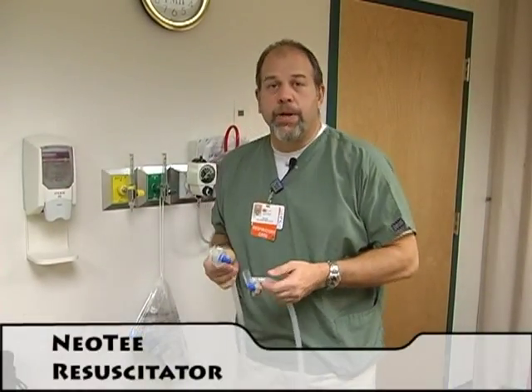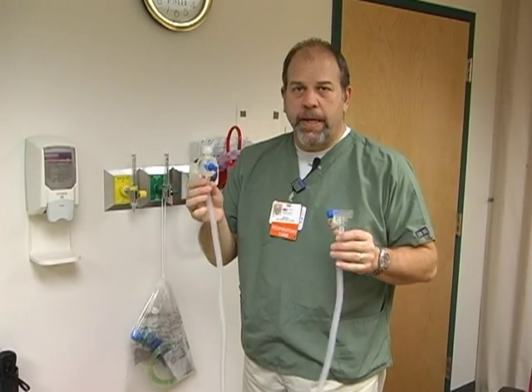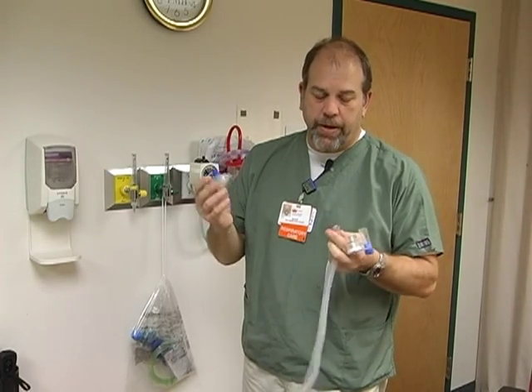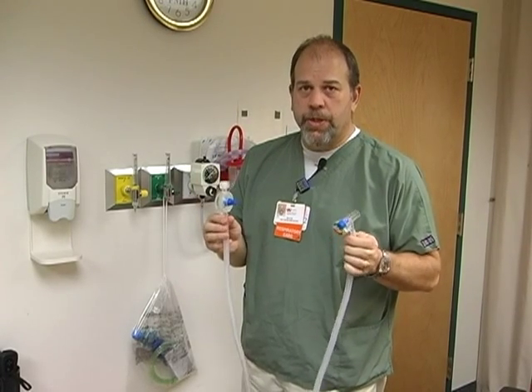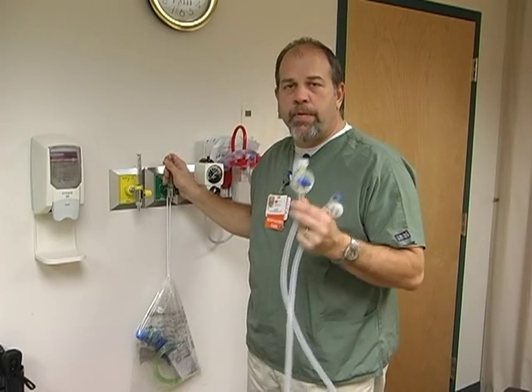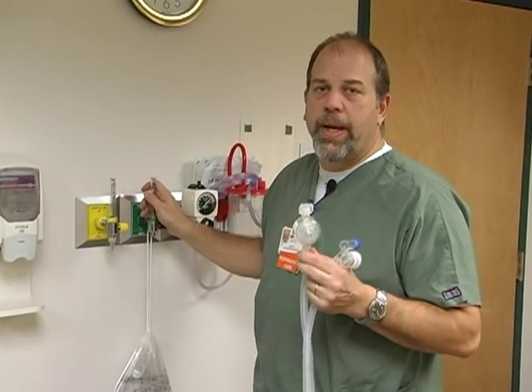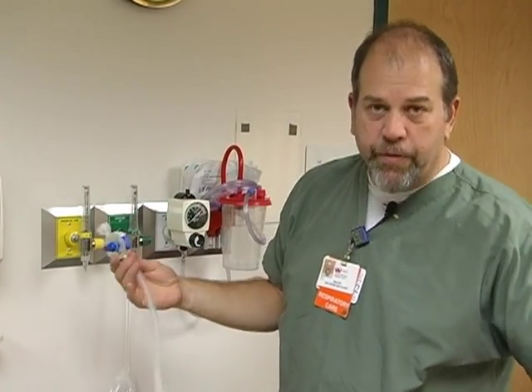Now I'm going to talk about a new device called the Neo-T Resuscitator. This is in lieu of the Neo-Puff — you can use it with a Neo-Puff, but you don't necessarily have to because the circuit is detachable. This is a lot more convenient. It's a single-patient-use disposable item that we can hook to any flow meter we have in the hospital.